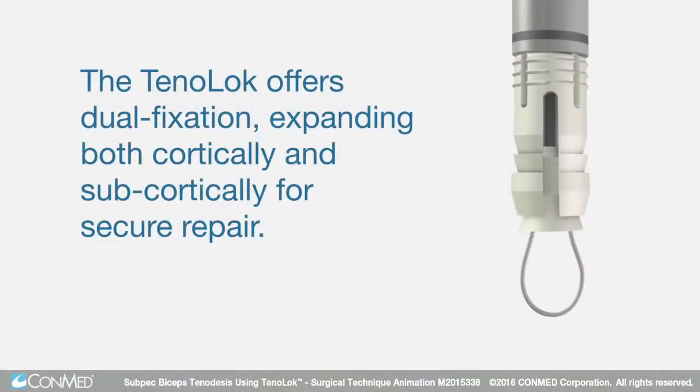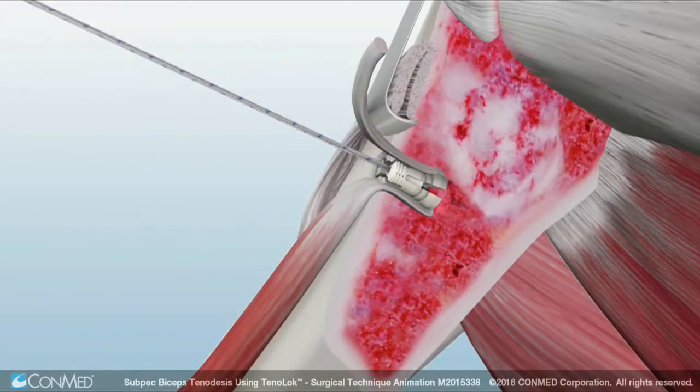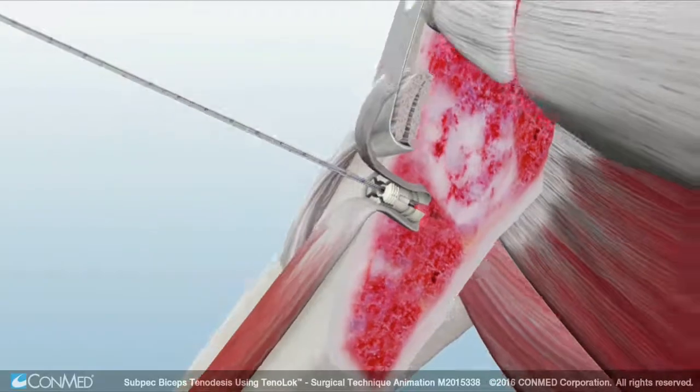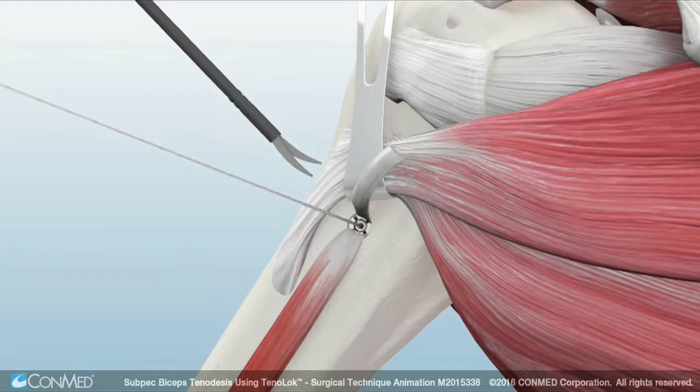Note that the Tenoloc offers dual fixation, expanding both cortically and subcortically for secure repair. Next, disengage the driver from the implant, loosen the cleated sutures, and remove the driver. Now cut the excess tendon.